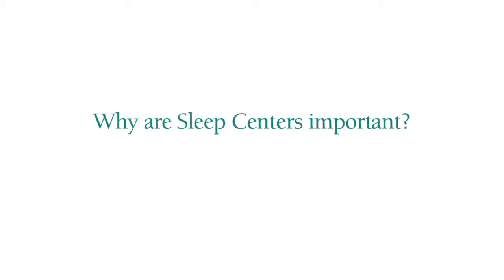There are a lot of ways that a sleep lab can help. I think when a physician is faced with someone who comes into his or her office complaining of sleep problems, it encompasses a huge group of disorders that may cause troubles, from insomnia to overdrowsiness from something like narcolepsy or one of the other sleep conditions like restless leg syndrome, obstructive sleep apnea, central sleep apnea. So a specific sleep test is markedly helpful in determining what might be the nature of that sleep disorder. Without knowing the cause of the problem, the drowsiness or the poorly restorative sleep, it's very difficult for a physician to tailor the proper treatments to treat sleep apnea. And that's where a diagnostic center comes in.